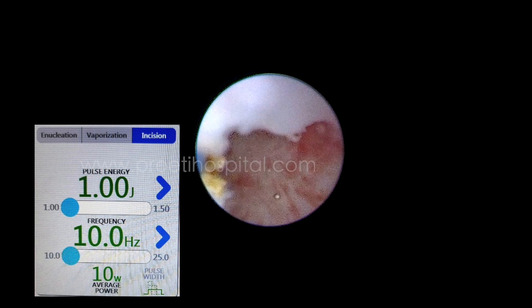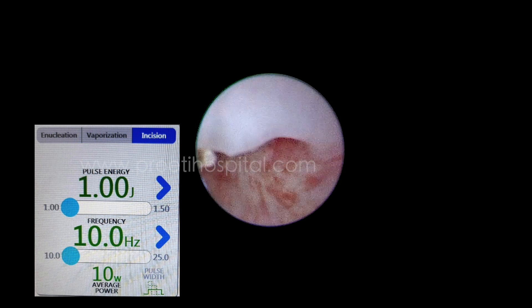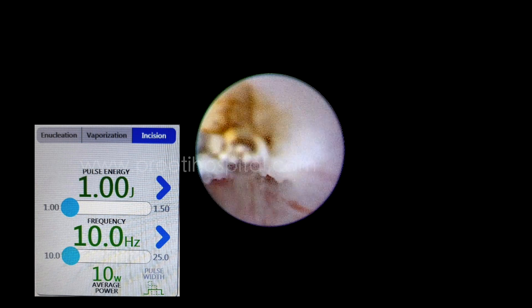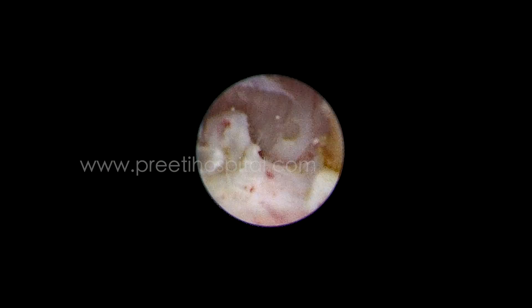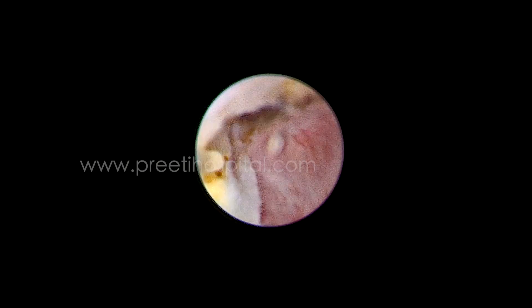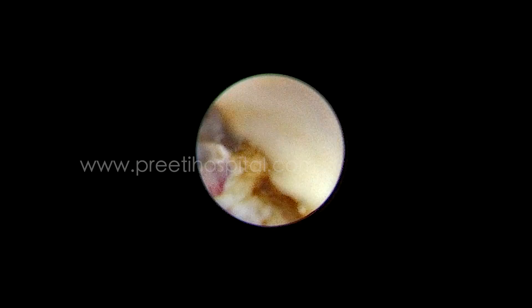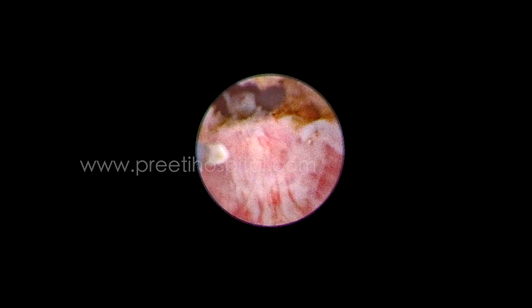We have learnt this from a senior pediatric urologist who used to guide us. He does not use this laser but he would guide us every time, and we could understand the technique. Our results are convincing, which is why I am sharing the video. This part is not the real obstructing area — the laser should go slightly anterior.